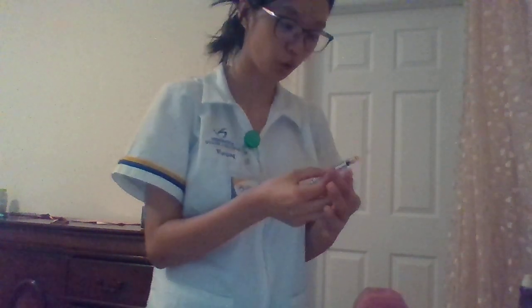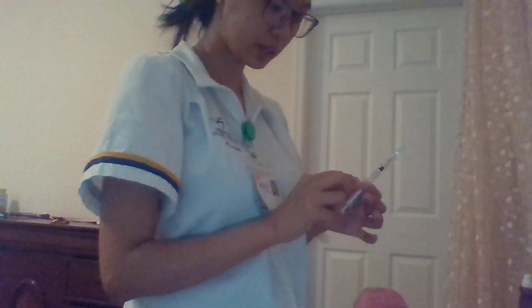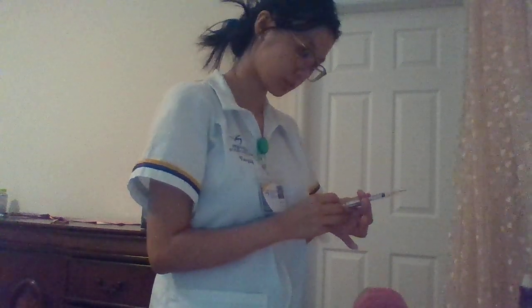And I'm gonna write the time now, and I am gonna put my initial on the label, and also the time and date. And after that, I am gonna open my needle by using the rainbow technique, and I am gonna draw 0.5 milliliter, which equals the dose I'm gonna administer to the patient.